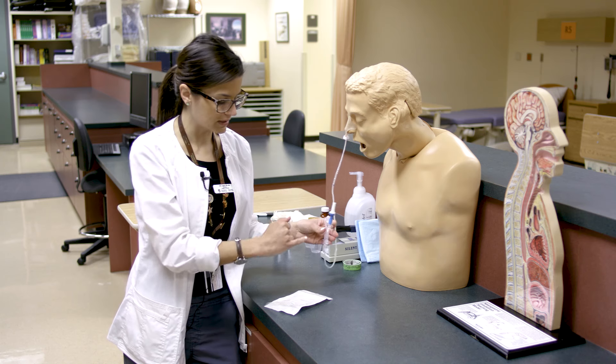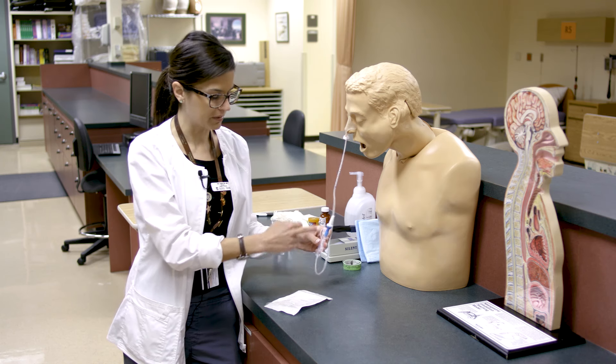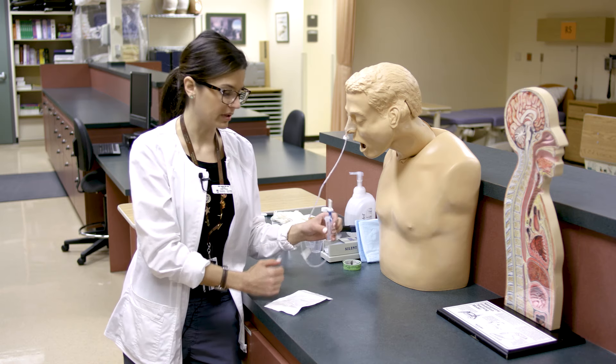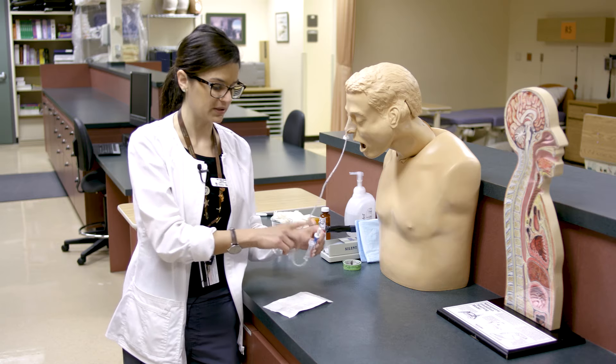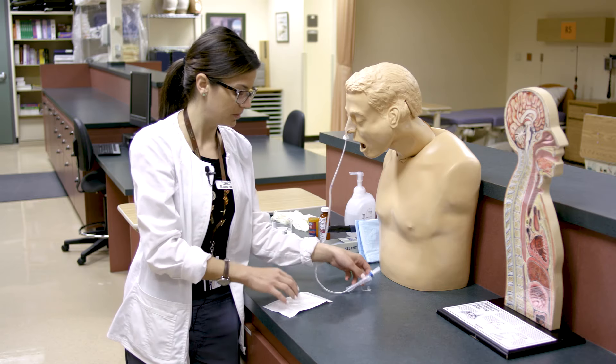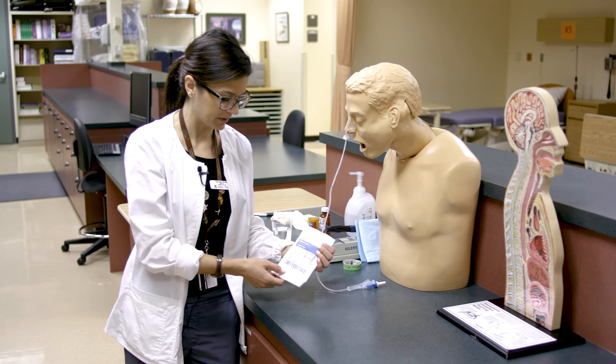This stays like this for feeding, and if you're doing decompression as well, it helps prevent the gastric contents from coming back up. Something to remember — hopefully over time they'll start to package this with the tube itself, but for now it's packaged separately.